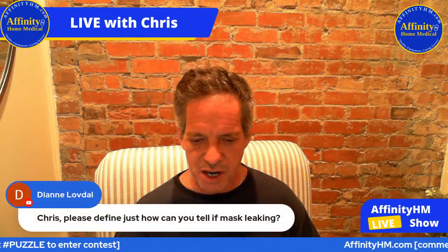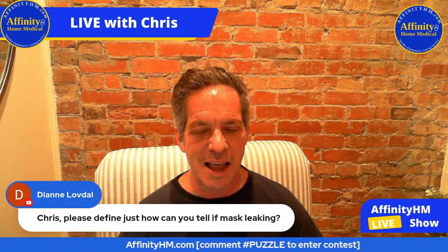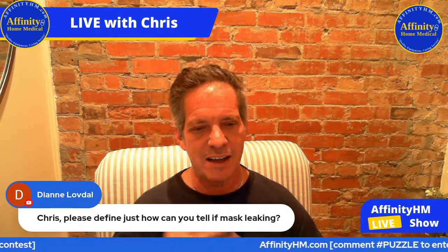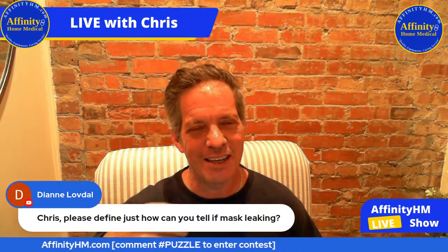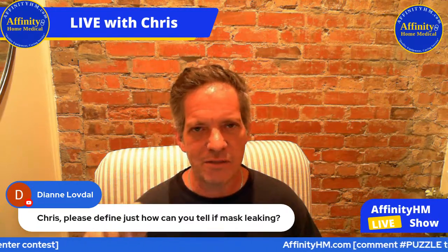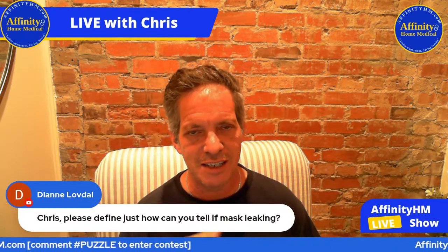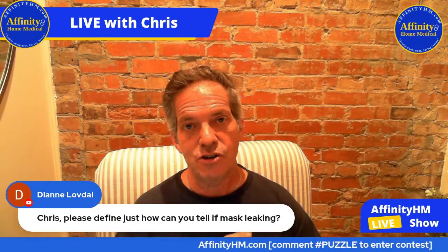All right. Here's a great question. Diane has a question. Chris, please define just how can you tell if a mask is leaking? Actually, that's a really great question. So, especially for beginners, let me point one little thing out. If you're brand new on CPAP, you may have noticed somewhere in your mask, no matter what kind of mask you have, there should be a bunch of little holes somewhere where some diffuse air is leaking all of the time. Well, that needs to be there so that when you exhale that carbon dioxide, it's going to escape the system right there. So right there at the mask, there's a continuous and purposeful leak somewhere in the mask. Outside of that, there should be no air leak.